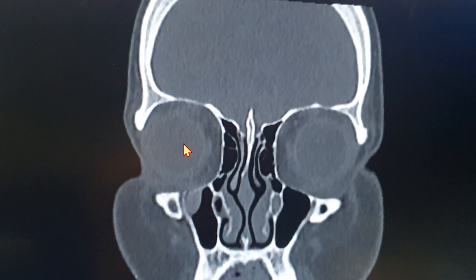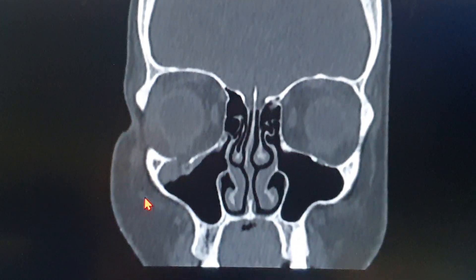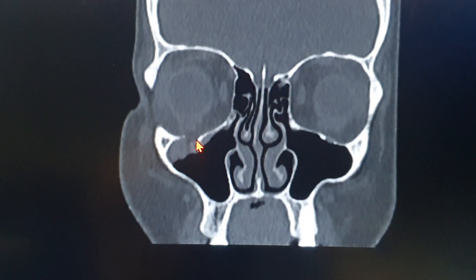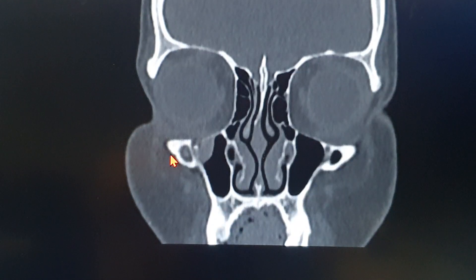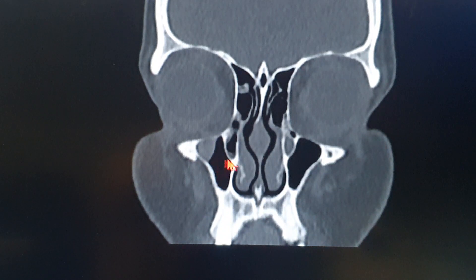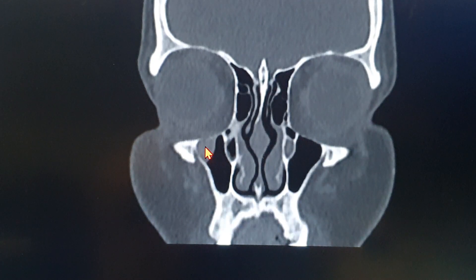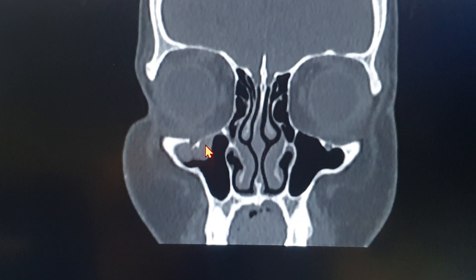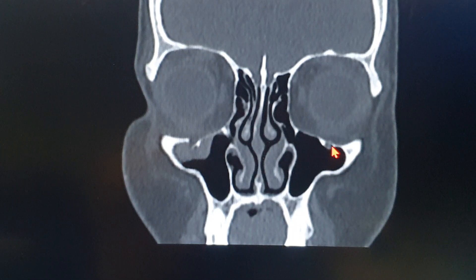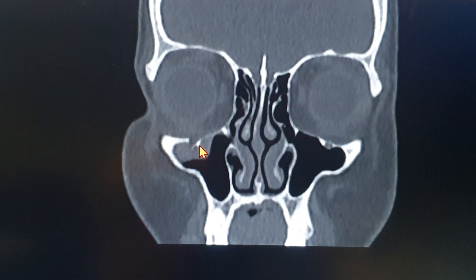As I go further back, your main aim is to see the area and location of the blowout fracture. You can actually start seeing the fracture line here. Compare both sides — right and left. Going anteriorly you can see the very anterior aspect of the maxillary sinus with some opacification and soft tissue shadow. The bony floor here looks intact, similar to the left side. But as you keep going back, you can see a deficient area on the right side — an actual breach in the continuity of the bony floor, or the roof of the maxillary sinus.